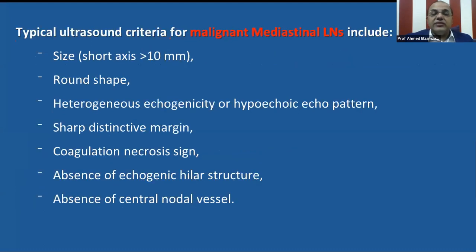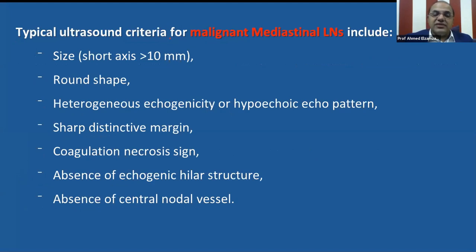Typical ultrasound criteria for malignant mediastinal lymph nodes include size with short axis more than 10 millimeters, round shape, heterogeneous echogenicity or hypoechoic echo pattern, sharp distinctive margin, coagulation necrosis sign, absence of echogenic hilar structure, and absence of central nodal vessel.